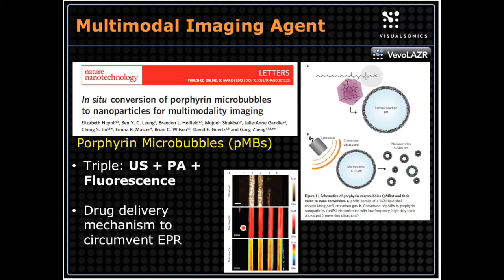So I want to bring your attention to this figure here. This is the principle they're using, where you have a relatively large microbubble, probably 2 to 3 micron, around that size range, and you're converting it into something 5 to 500 nanometers, so truly a nanoparticle.